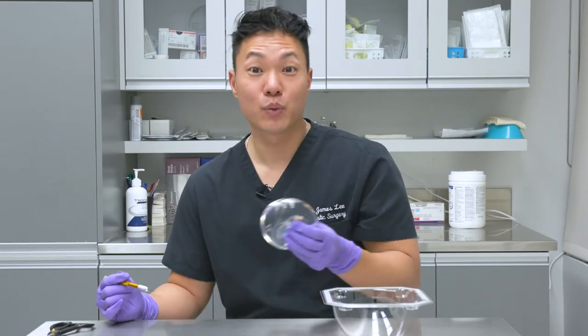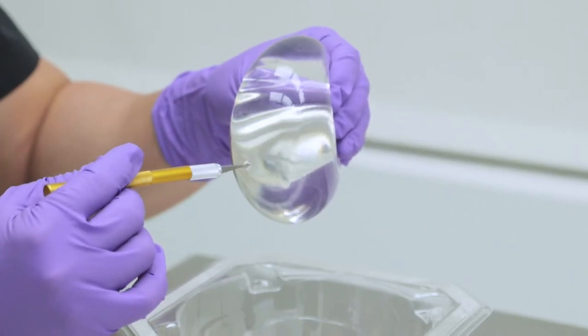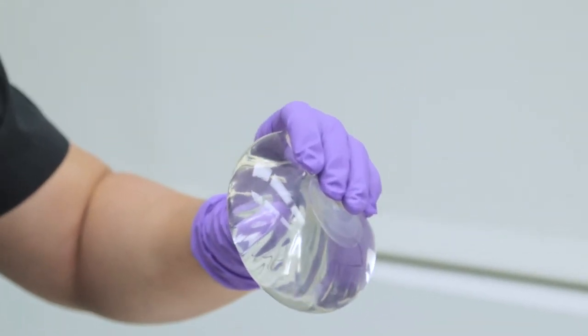So now we'll demonstrate what happens if there is a hole in a silicone gel implant. As you can see, there's no silicone leaking — it keeps its shape and it won't deflate.